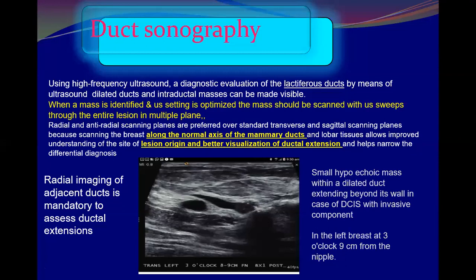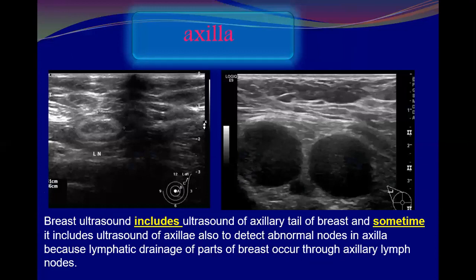But generally, as a rule, we have to consider radial scanning for the duct. It is mandatory to scan the duct with a radial technique. Okay. Remember to scan the axilla.